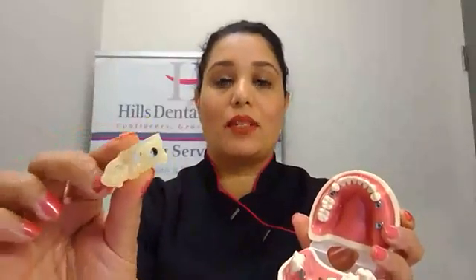We print it out from a 3D printer. We don't do it, it's actually outsourced. The reason for that is it sits very, very snug on the missing space. So this is the missing space, this is where we want to do the surgery, and then we fit that in. What does it mean to a patient? For a patient, it means that there is no cutting, there is no bleeding, and there is no pain. That's why we would love to have guided surgery.